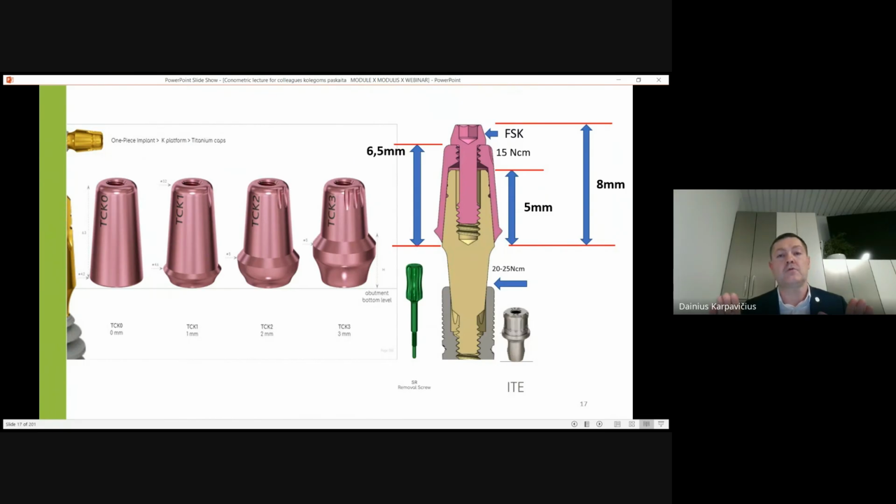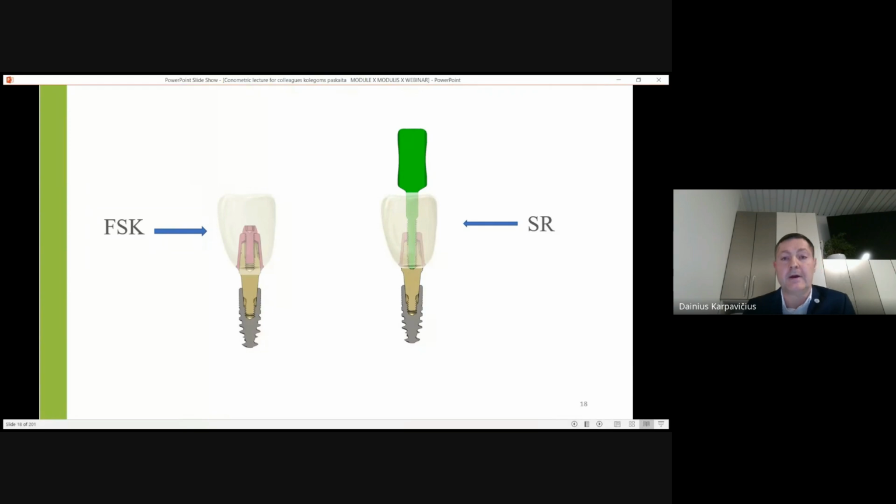Later on, tissues might get peri-implantitis, might recede, while we are submerging everything, because technically it asks us to go deeper. Then you receive a much more physiological outcome of the prosthetic solution, of the prosthetic construction.